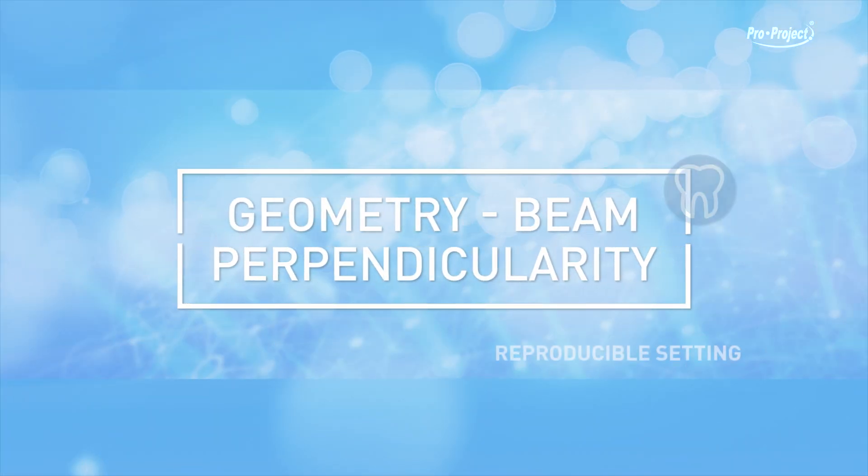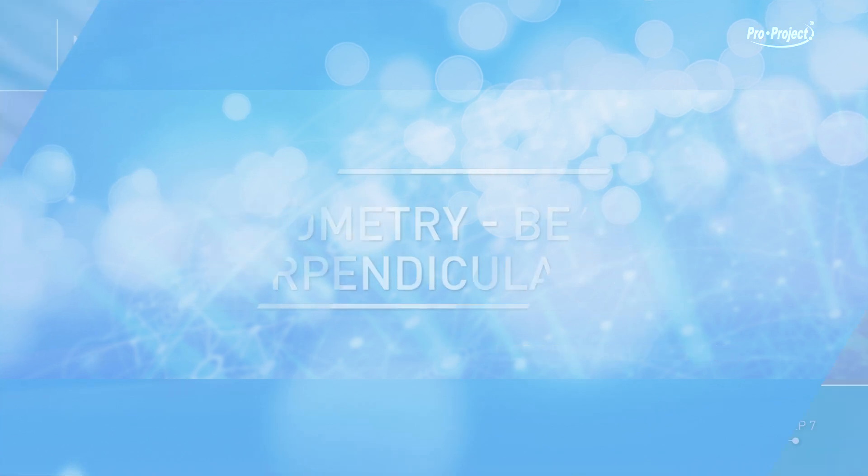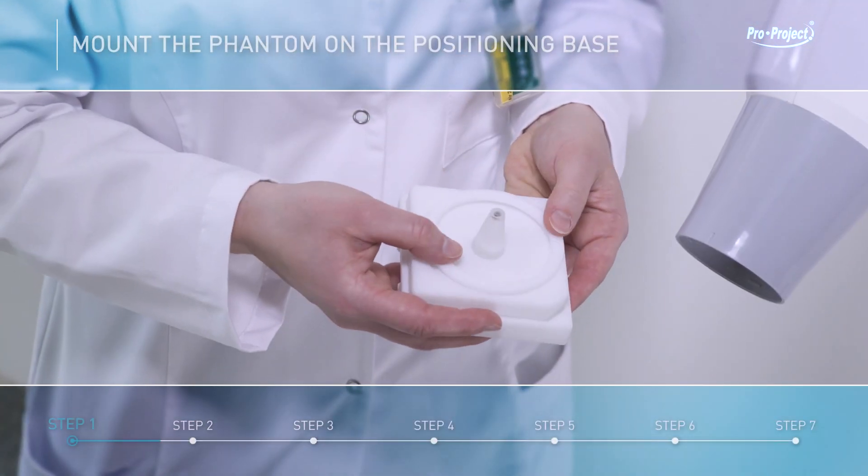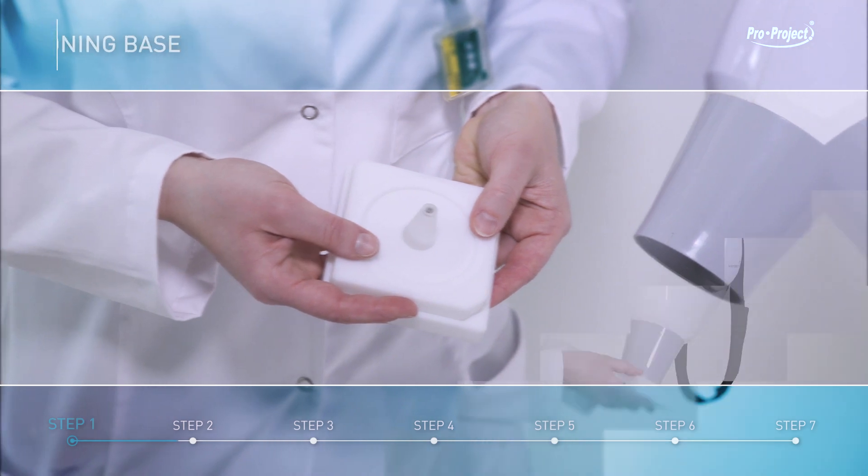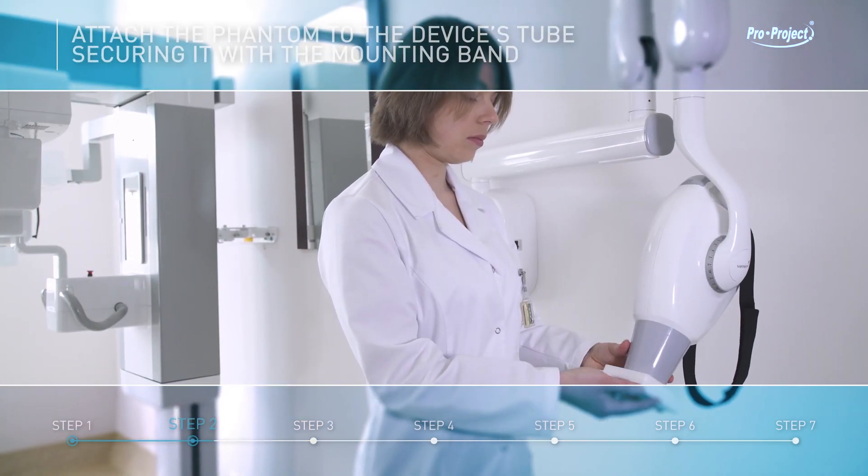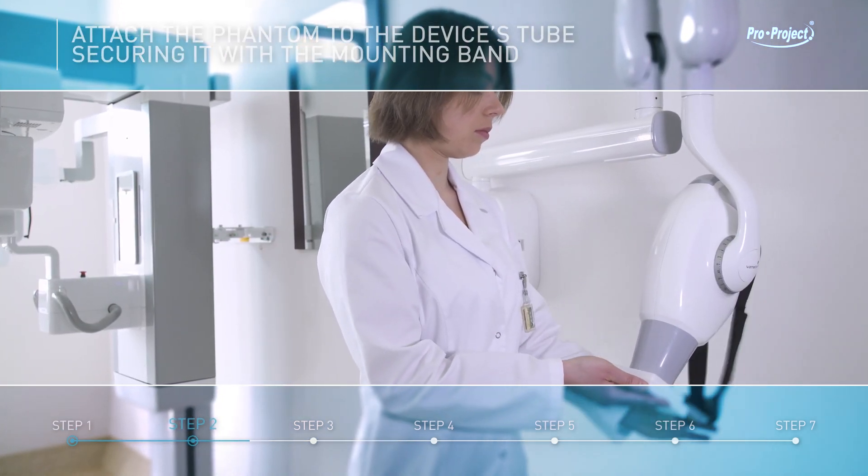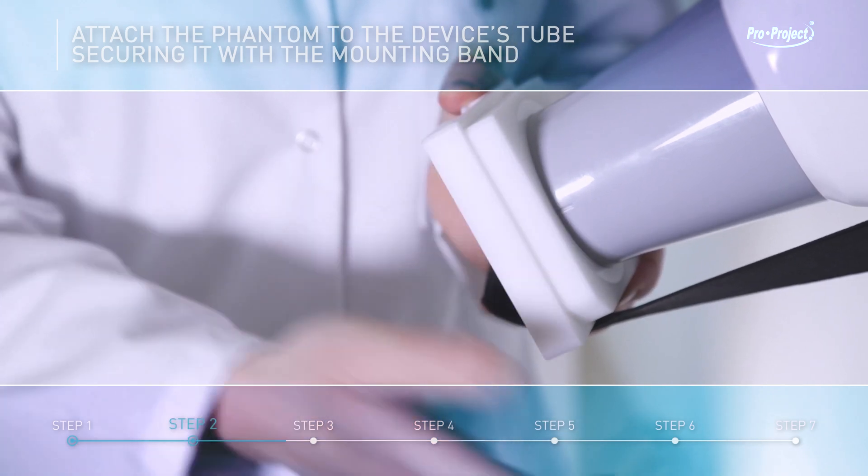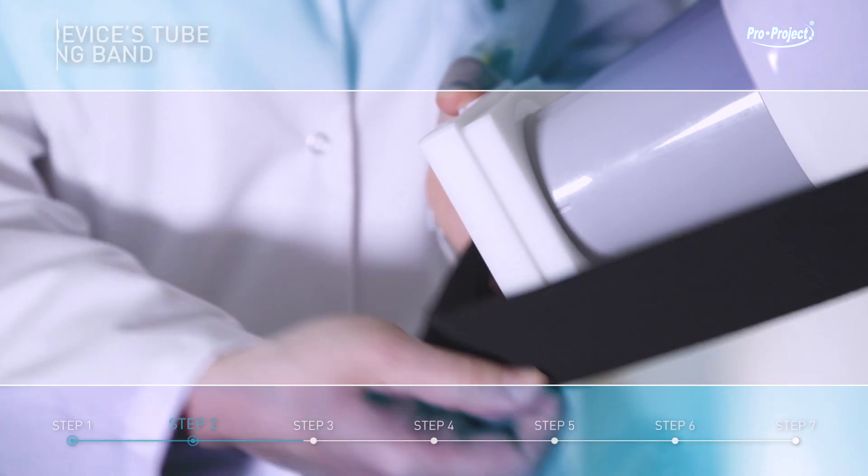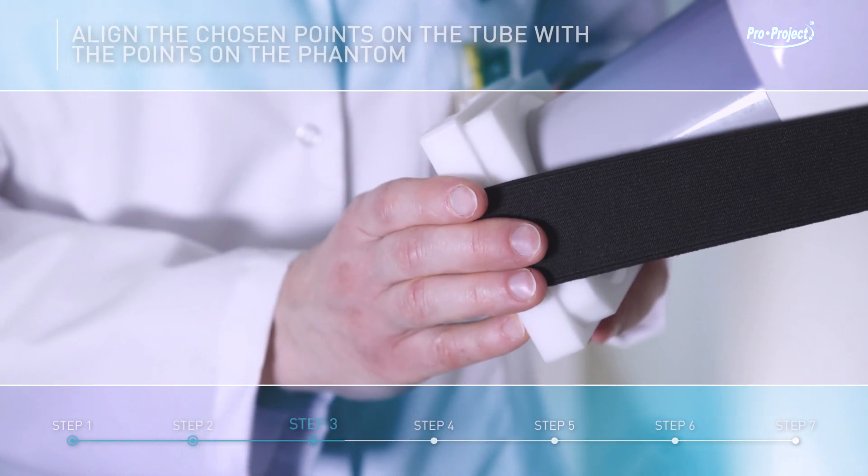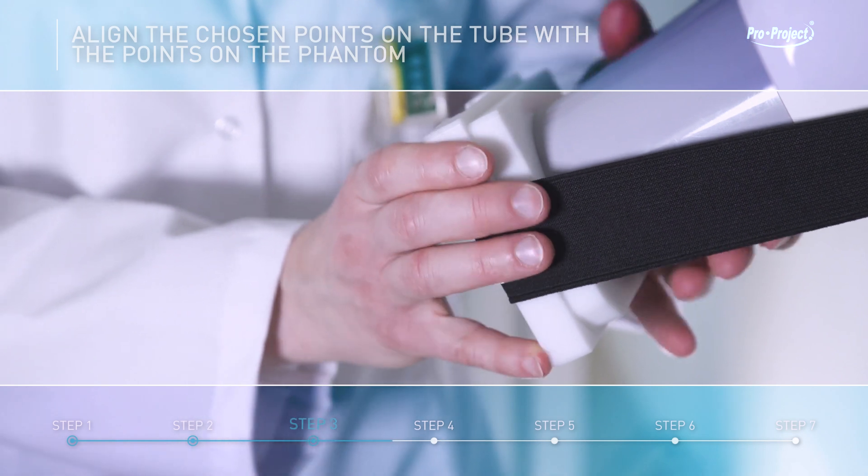Geometry, beam perpendicularity, reproducible setting. Mount the phantom on the positioning base. Attach the phantom to the device's tube, securing it with the mounting band. Align the chosen points on the tube with the points on the phantom.